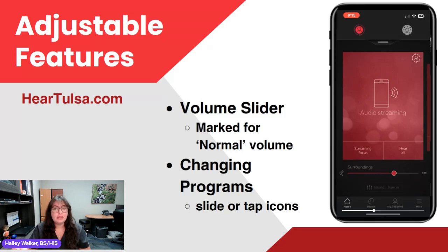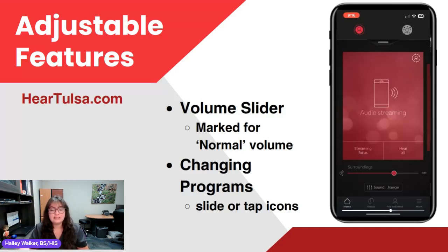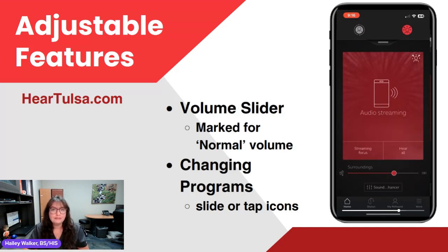If we click on that sound enhancer, it'll show us what it's already at. We can pull bass, middle, or treble up or down, depending on what we need. When we find something we like, we can just hit that X at the top and it'll stay at that setting. If we want to make it into a new program, we would hit save as custom at the bottom.